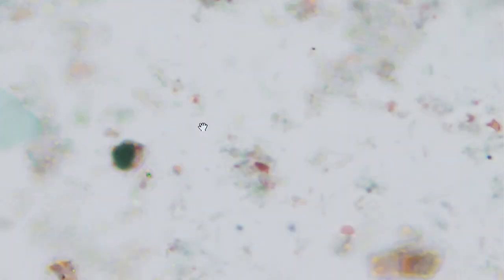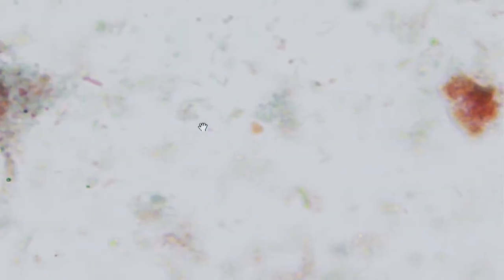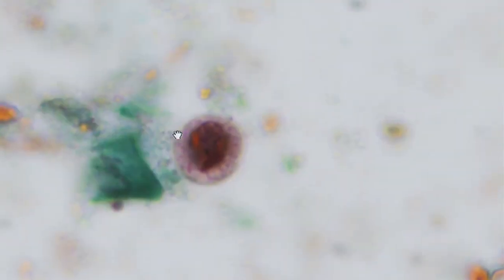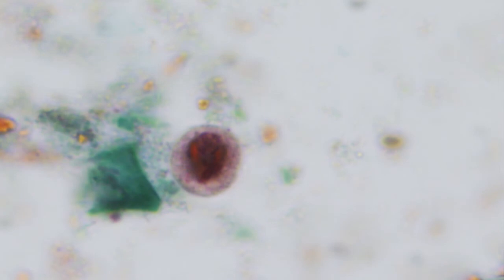Blastocystis hominis in trichrome stain. So just so that you can see what a Blastocystis looks like. That's another protozoa, very common in the developed world. The most common parasite of people in the developed world is Blastocystis hominis. But in here is another Entamoeba, very interesting looking one. I'll just move it more centrally for you. What on earth is that? Now that's an interesting looking thing, isn't it?